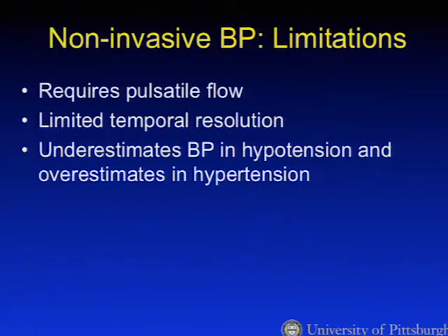Temporal resolution relates to the fact that sudden changes will not be detected instantaneously, as each measurement requires a certain interval of time to conduct. And at extremes of blood pressure, this technique is not accurate.